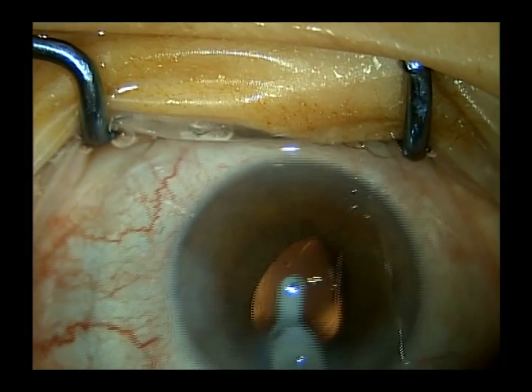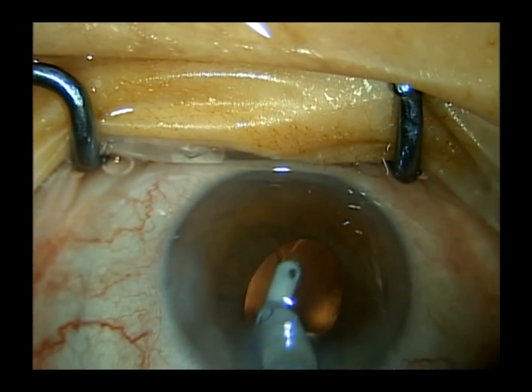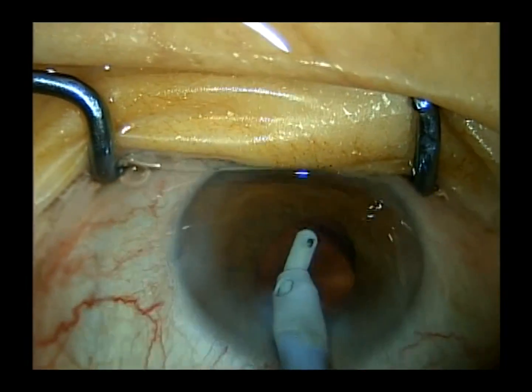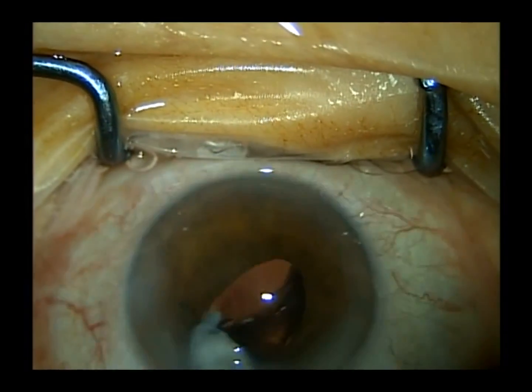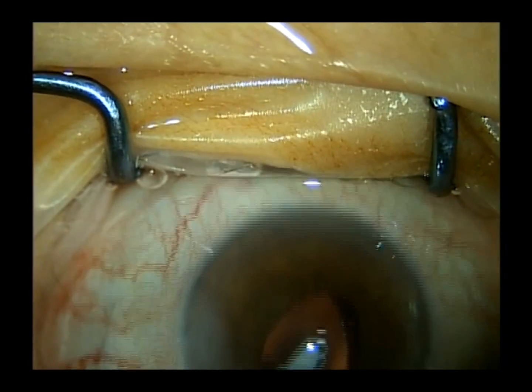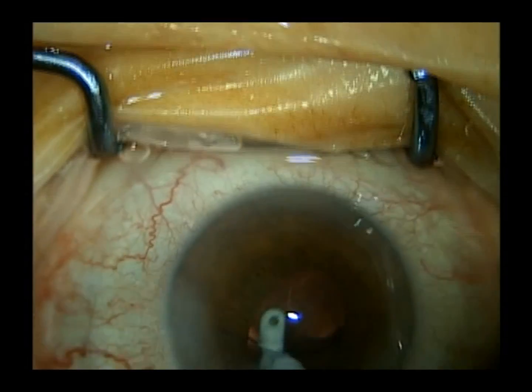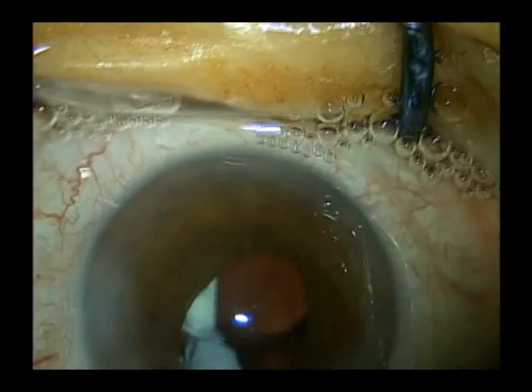I'll usually also place my irrigation and aspiration tip behind the lens at some point to aspirate the viscoelastic from behind the lens. Here my tip is behind the lens, and I'm just aspirating out the visco that may be trapped behind the lens.